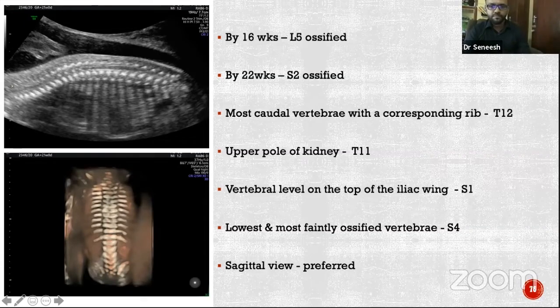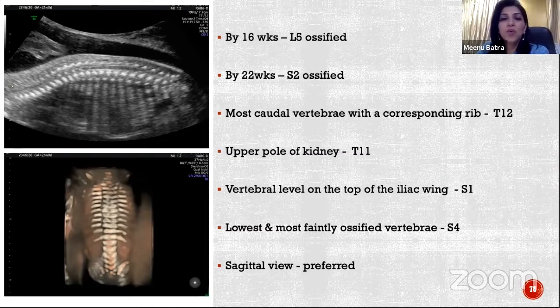Or yeah, roughly, if you look at the kidneys also, I think it corresponds to around the L1, L2 level, which tells you that the conus would also be at the right level if you're not able to count all the time.